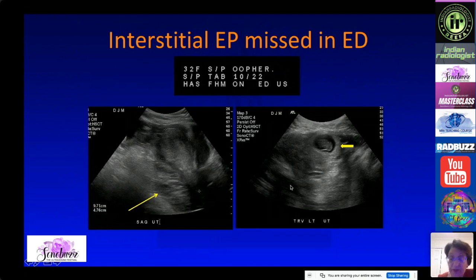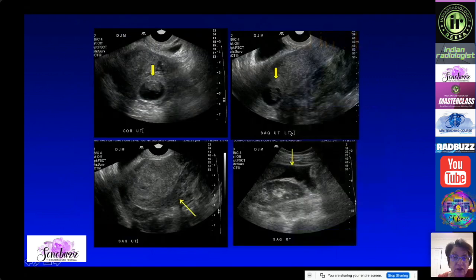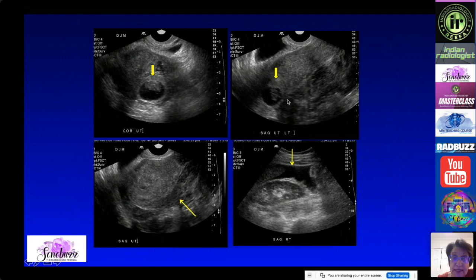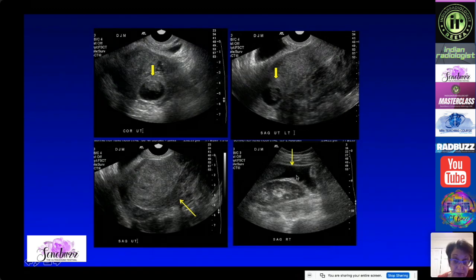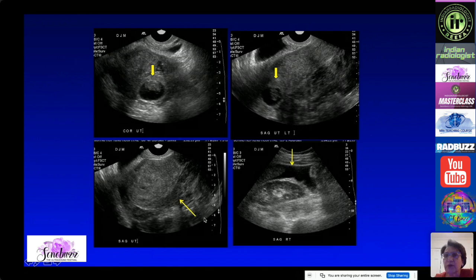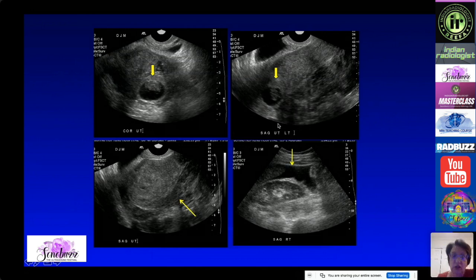On endovaginal ultrasound you can see myometrium on one side but no myometrium on the other side. The pregnancy is intimately related to the uterus and there was a large amount of blood. This patient became hypotensive very quickly, was shipped to the OR, and was found to have a ruptured interstitial ectopic pregnancy.